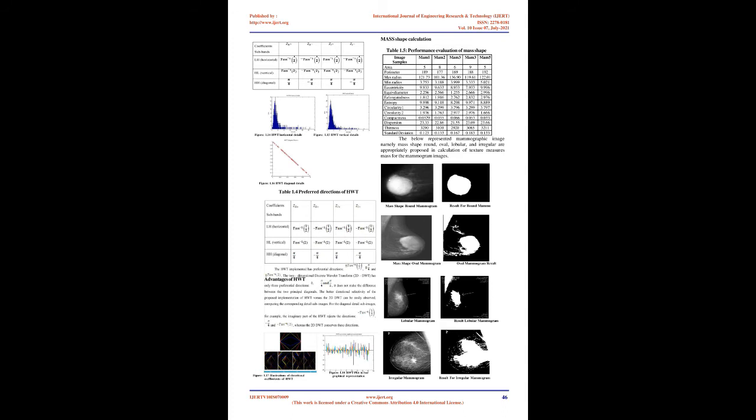Adaptive bilateral filter smooths pictures while conserving edges, and suggests a nonlinear combination of nearby image values. Our proposed bilateral filter comprises two component filters, a domain filter and a range filter. Bilateral filter is the product of domain and range filters. It is observed that using the adaptive bilateral filter increases the PSNR value and decreases the MSE.